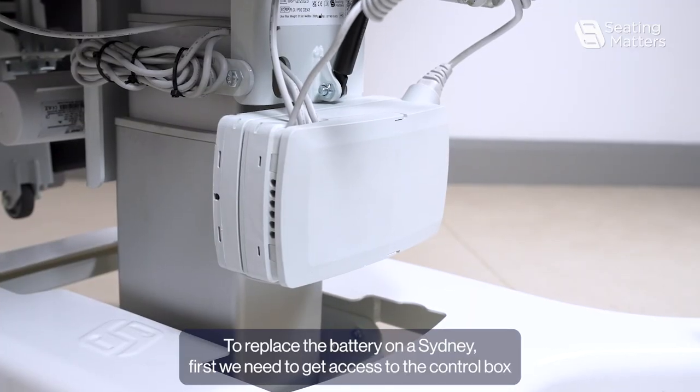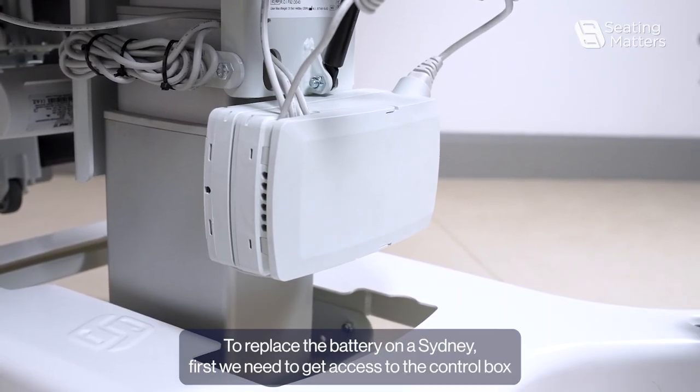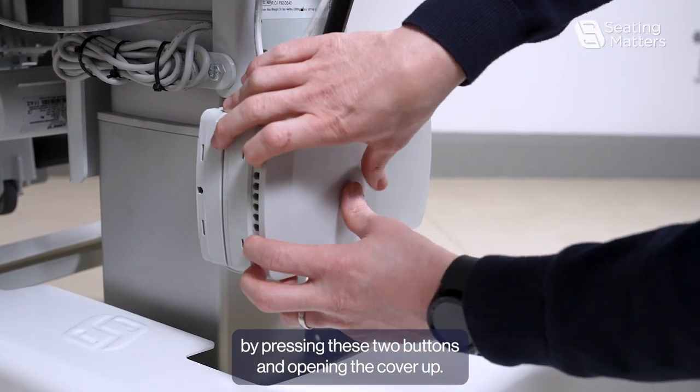To replace the battery on a Sydney, first we need to get access to the control box by pressing these two buttons and opening the cover up.